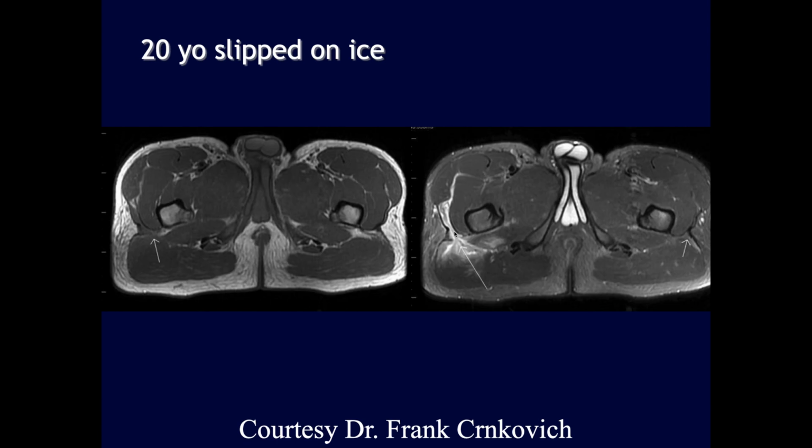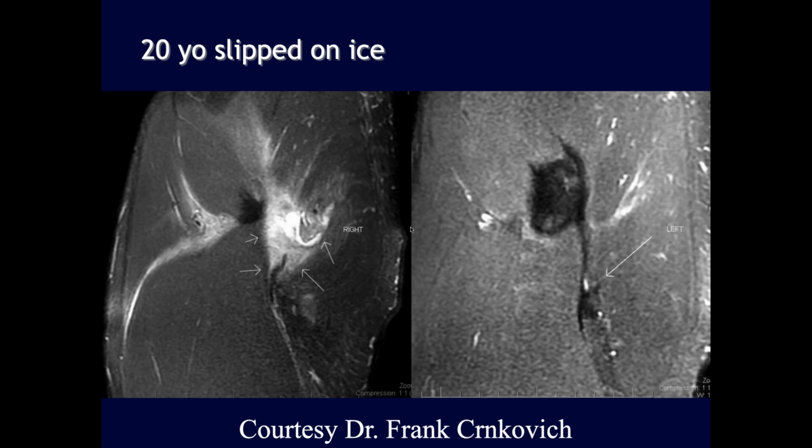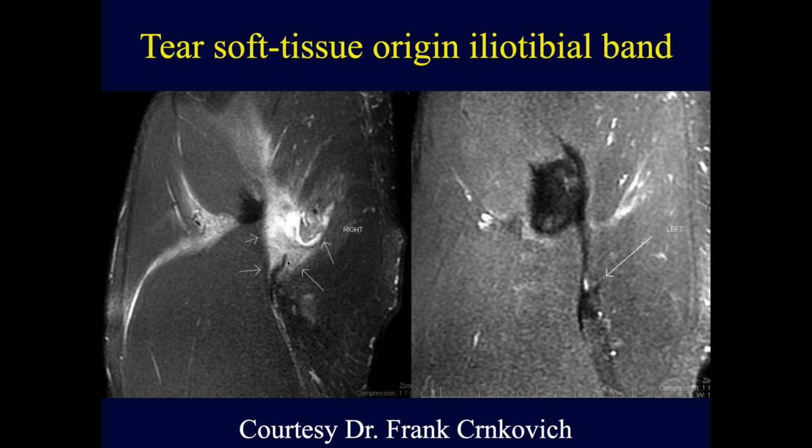Did you say partial? Yes, I think some of the fibers are still intact. It's a large muscle, the IT band. Okay. So it's primarily a tear of the IT band, but there's probably, that's one area where the inferior arrows are. That looks like a complete tear, doesn't it, John? Right. Yeah. Okay.